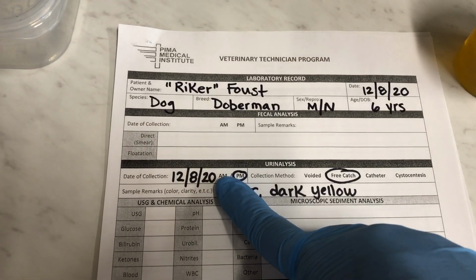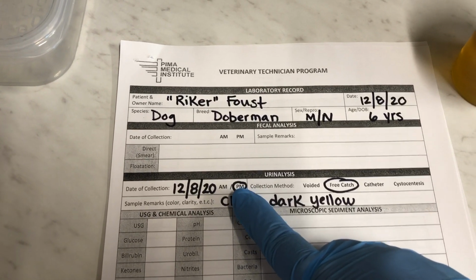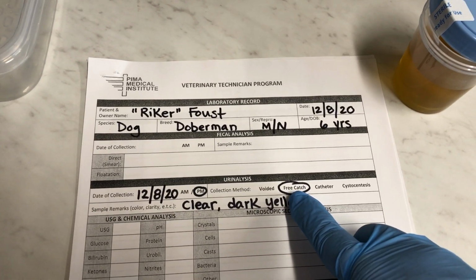We also need to know a general time frame of when the urine was collected so we know how old it is. So this was taken just this afternoon. Also, the collection method is very important to notate. So this was collected via free catch.